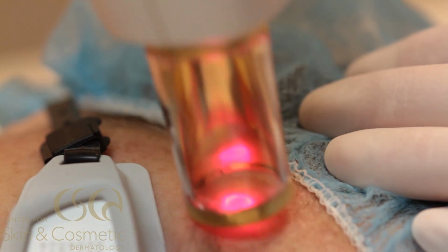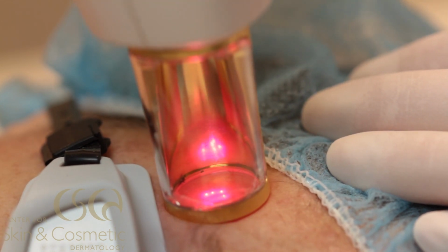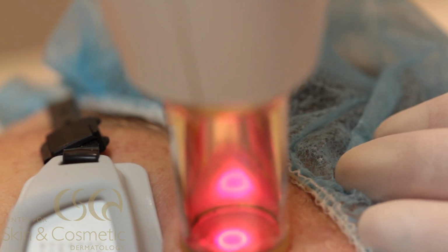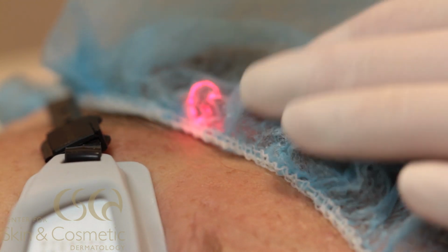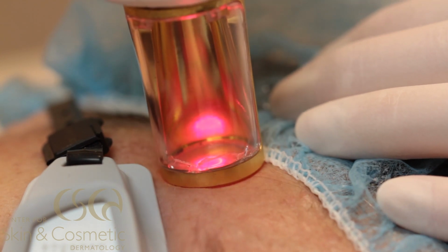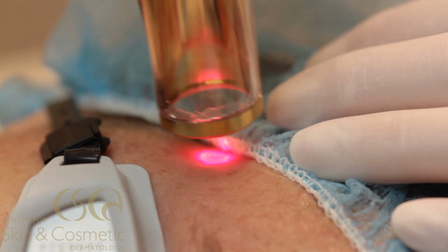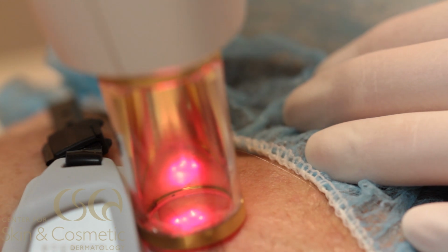When we're using the fractional component of this procedure, we are doing collagen remodeling, which is tone, texture, and tighten. And so in that, we're going to see patients who have some flaccid skin, loose skin tissue. We're going to treat patients who have the crepey tissue under the eyes, any loose skin that might need additional tightening or thickening of the skin, because as we age, our skin tends to thin. This procedure is great for thickening the tissue as well.